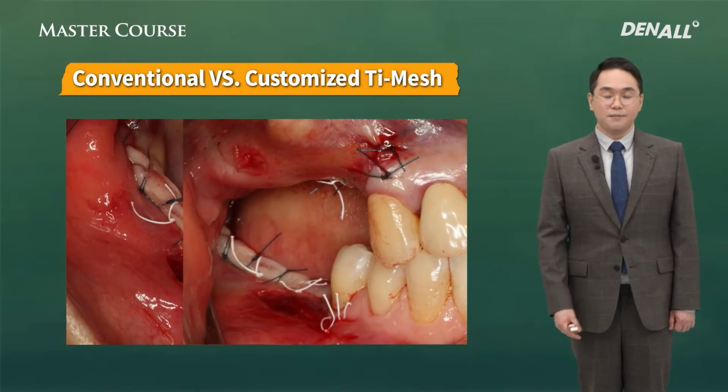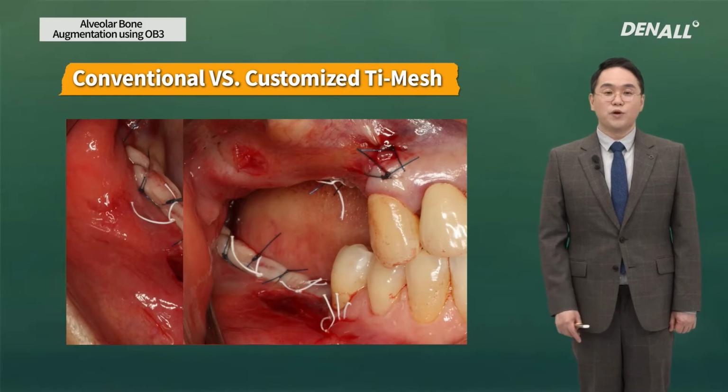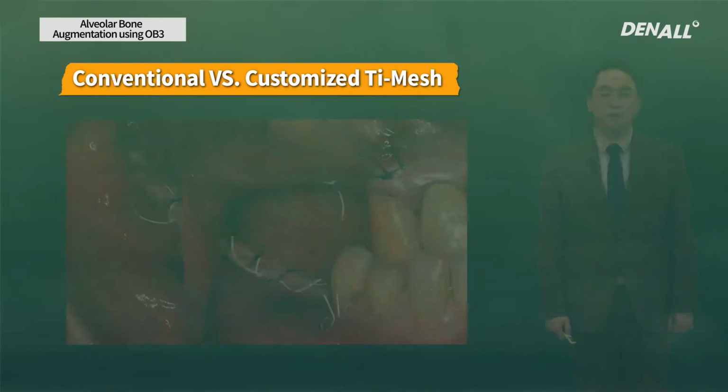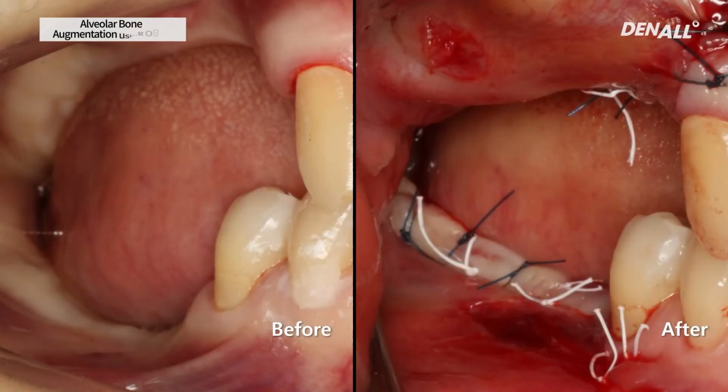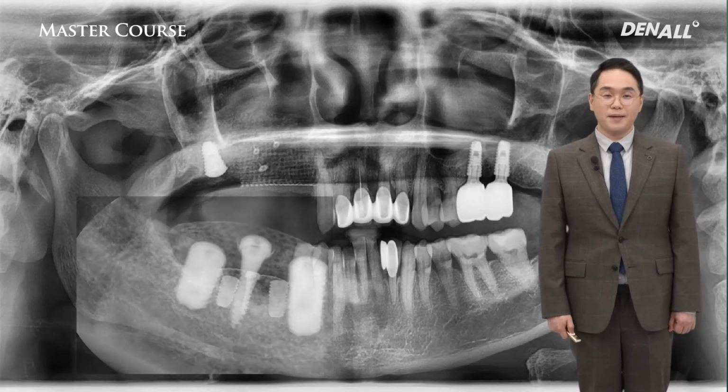After mandibular operation, the lateral photo, if you see it here, in both jaws, vertical alveolar bone is augmented. If you compare before and after, in both jaws, vertical bone defect was 4 millimeters or over. Post-op photo shows that vertical bone augmentation has been achieved. Post-op panorama and PA.